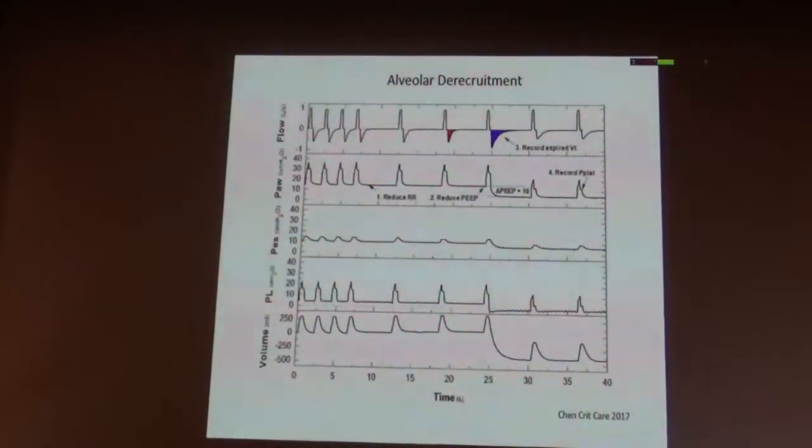If we find that the tidal volume exhaled is 300, or 310 or 350, we say this patient is not recruitable, so we should not use PEEP. If, by contrast, we find that the volume exhaled is 500 or 600, we say there was a lot of volume in addition to what was predicted by the compliance at low PEEP, so this patient is highly recruitable.